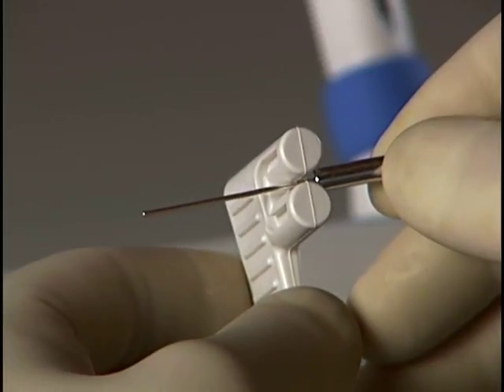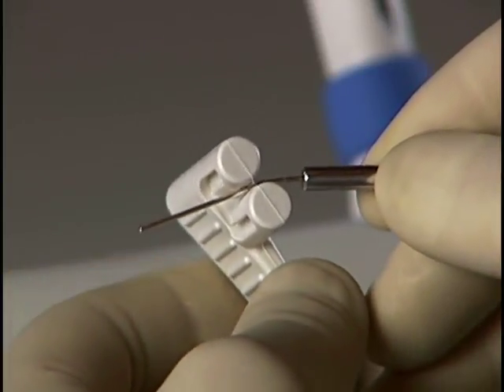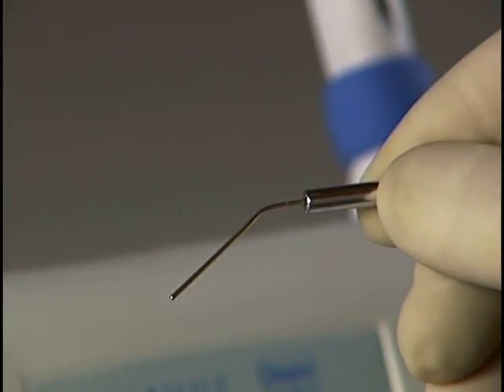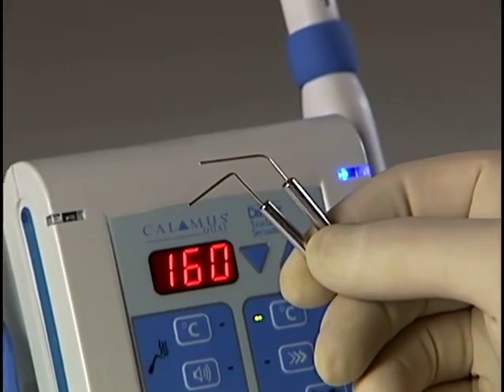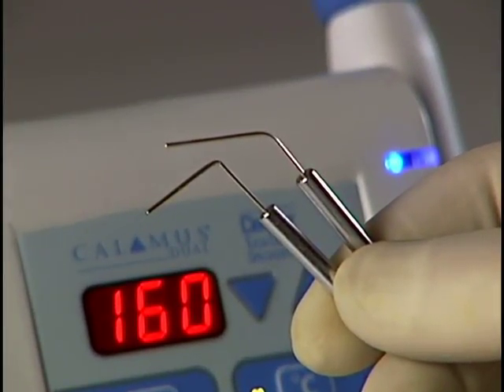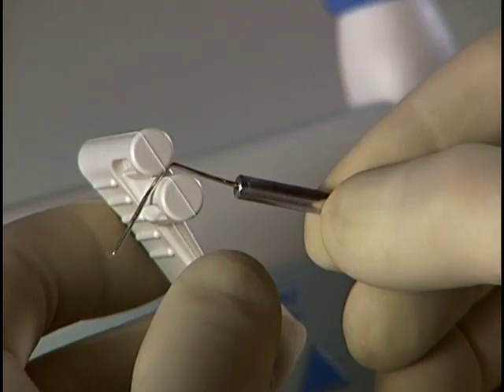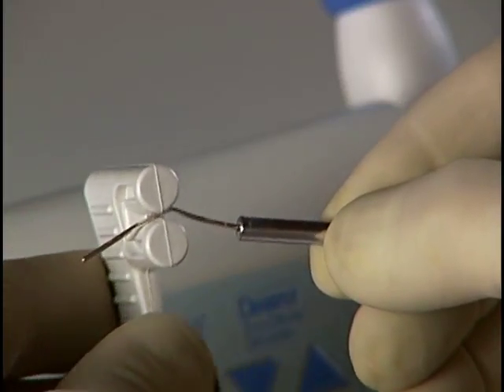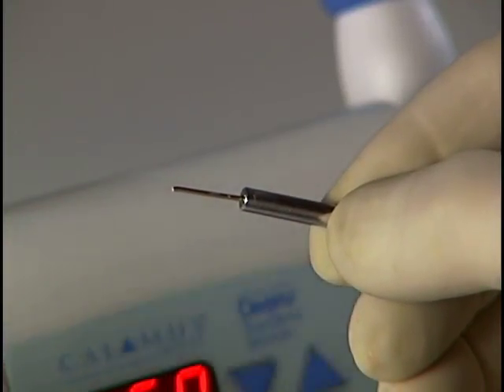Bending of the tips can also be accomplished before the calamus single is even inserted into the handpiece. Use caution — do not kink the needle, as this can cause flow problems. Also note that excessive bending and re-bending of these needles can lead to metal fatigue and subsequent fracture.